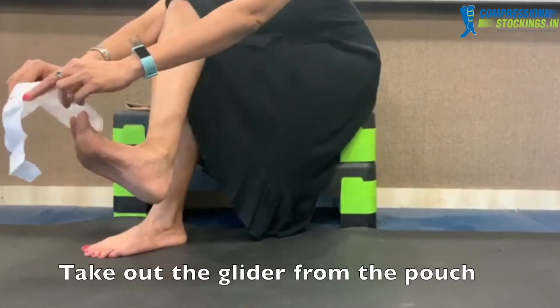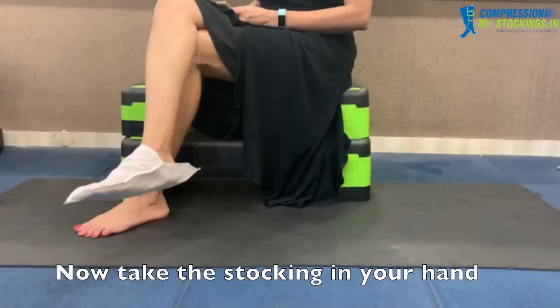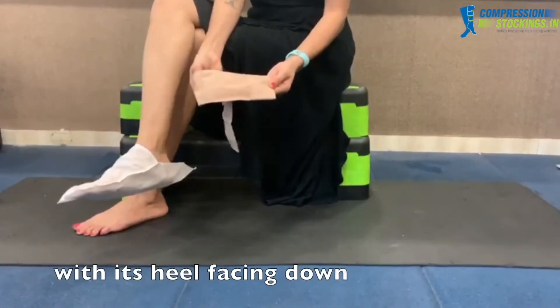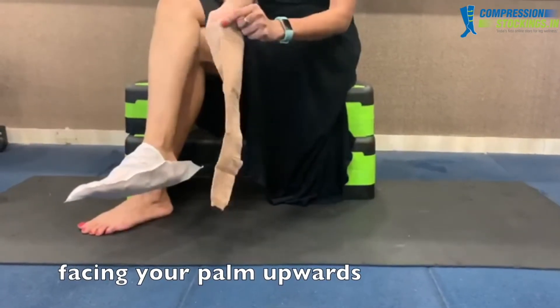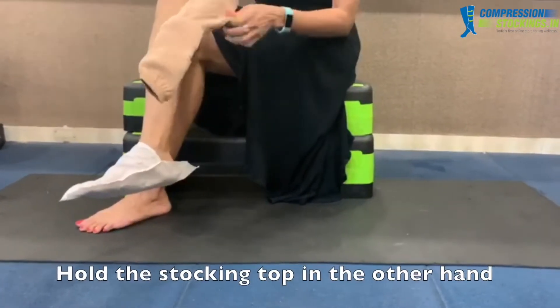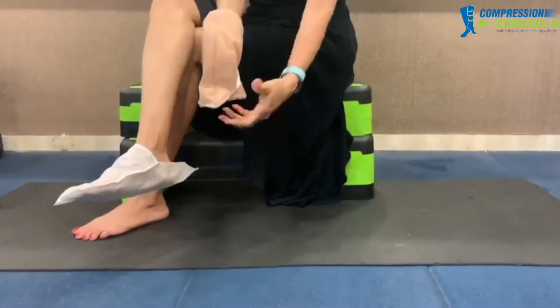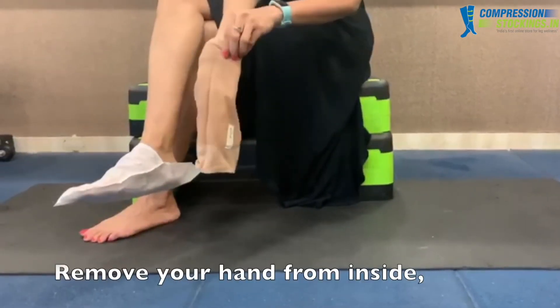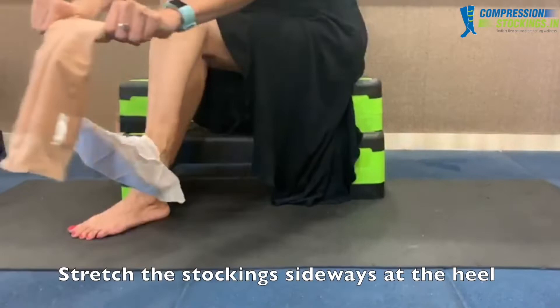Take out the glider from the pouch and wear it on your leg. Now take the stocking in your hand with its heel facing down. Put your hand inside the stocking facing your palm upwards. Hold the stocking top in the other hand and pull down, turning the stocking inside out stopping at the heel. Remove your hand from inside. Stretch the stocking sideways at the heel.